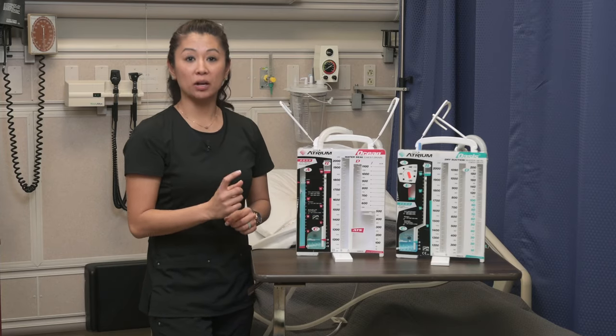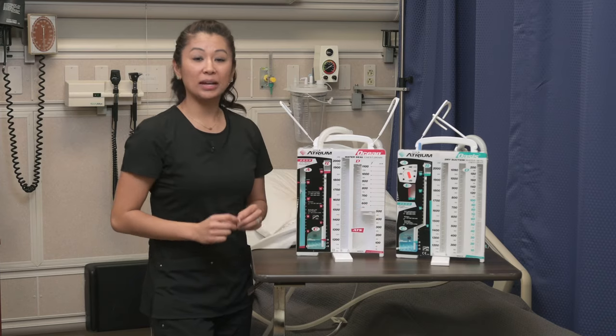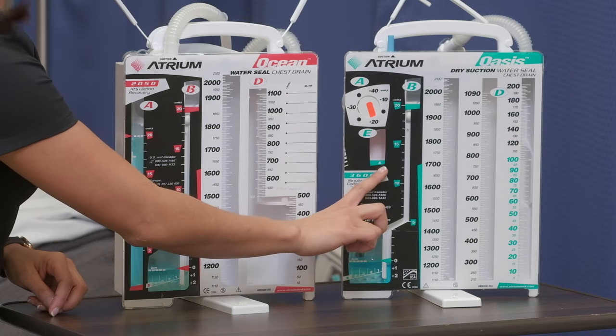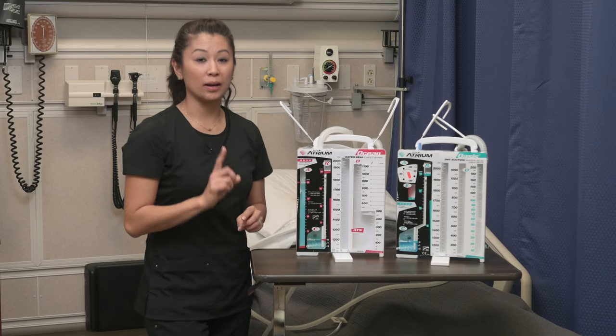One other important thing to note: if the patient is connected to suction, in the e-chamber you'll see a little orange bellow that's going to inflate toward the indicator arrow. That orange bellow inflated around that mark means suction is working.